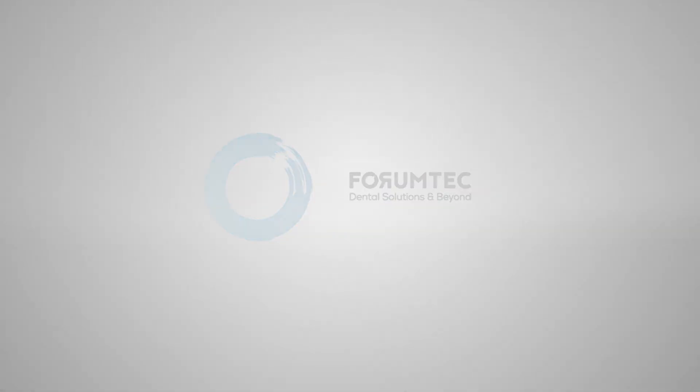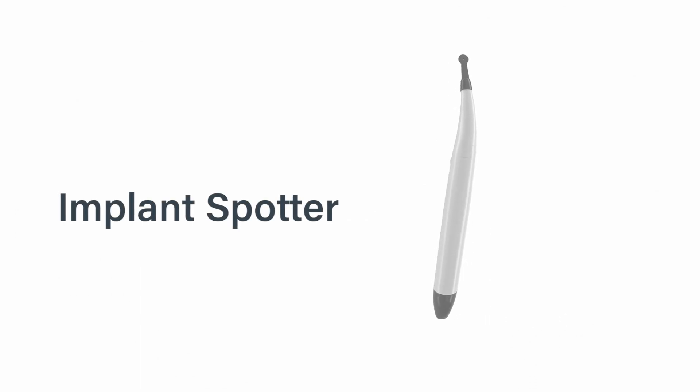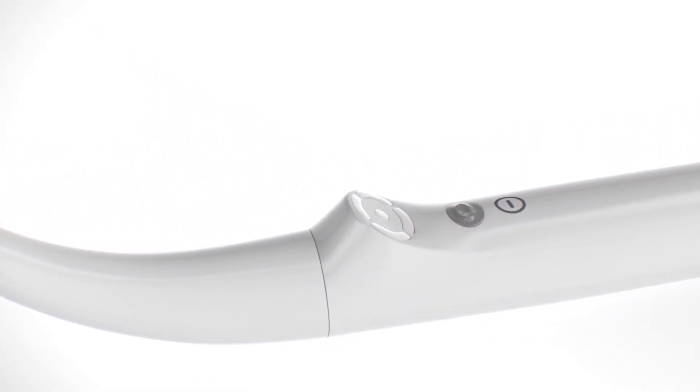Forum Technologies introduces a solution to implant localization. Insert the sensor into the holder until it stops. Turn the device on by pressing the on-off button.